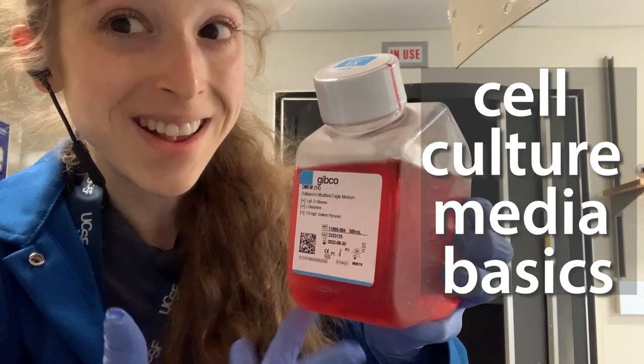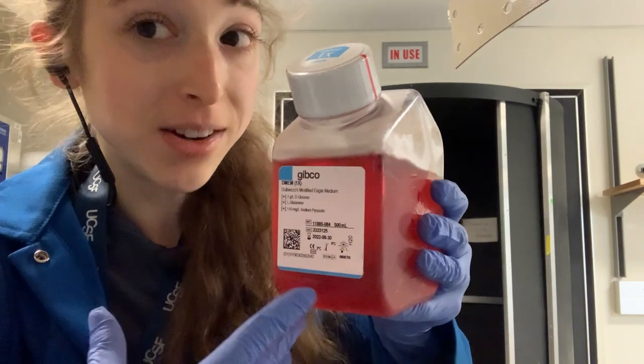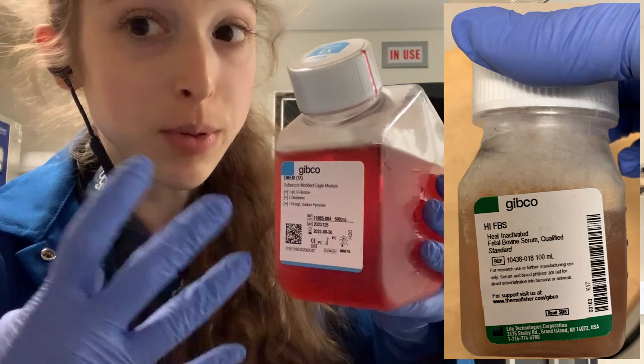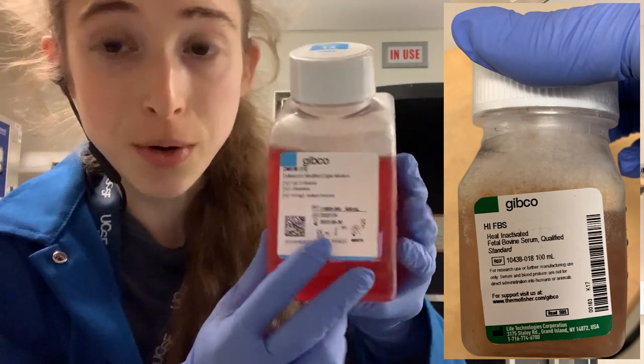This isn't bloody, at least not yet. The pink is just a phenol red pH indicator. Later I'll add fetal bovine serum, FBS, and this will provide nutrients to make this food even more nutritious for my cell culture.